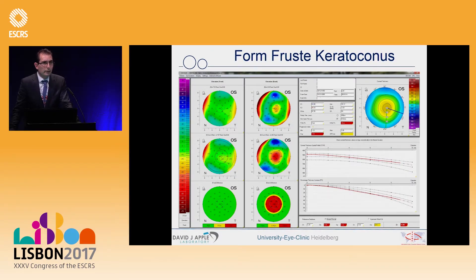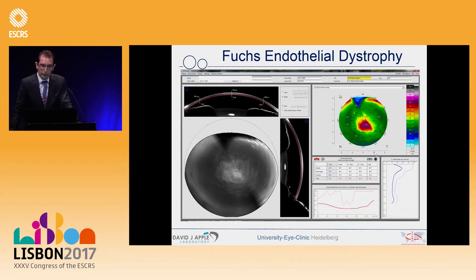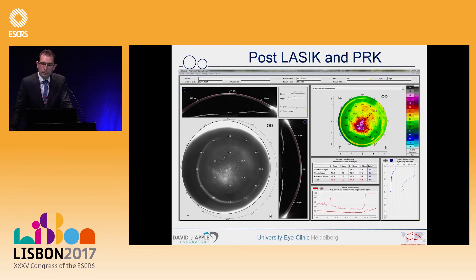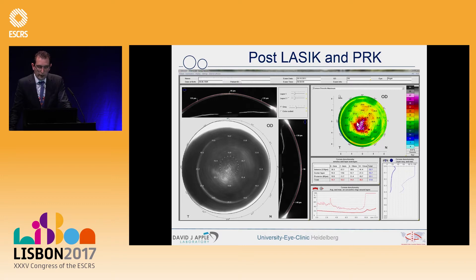Another condition to exclude before planning cataract surgery is keratoconus. You can see a Pentacam measurement that clearly detects this, and it must be ruled out before cataract surgery is considered. Similarly, for Fuchs endothelial dystrophy, you can perform a corneal density analysis — analogous to the lens nuclear staging with PNS measurements — for the corneal stroma. Even after LASIK or PRK, if the patient does not remember having such an operation years ago, you can easily detect this with a single Pentacam shot and account for its implications on IOL calculation.